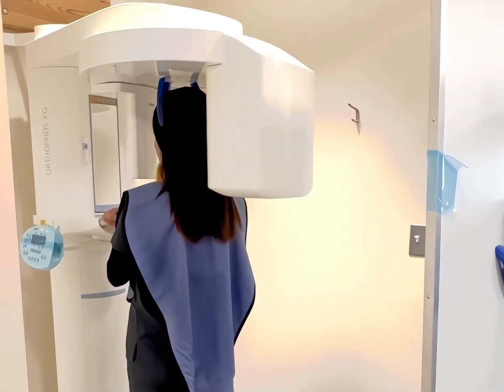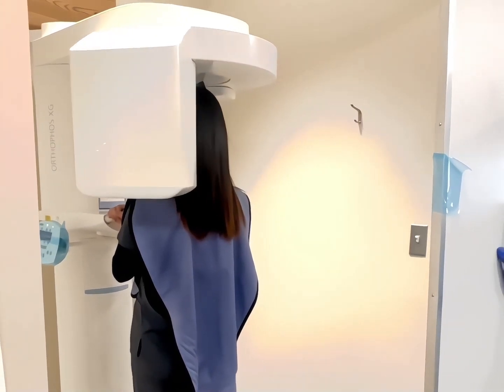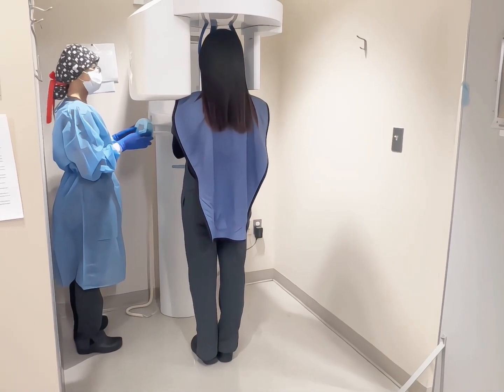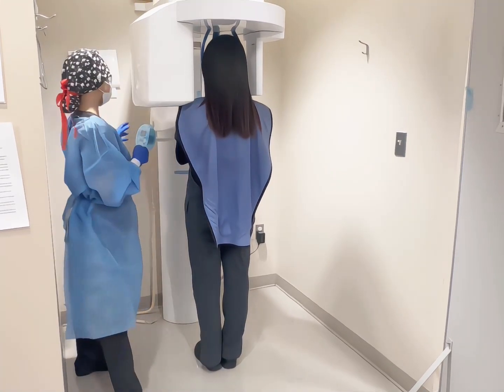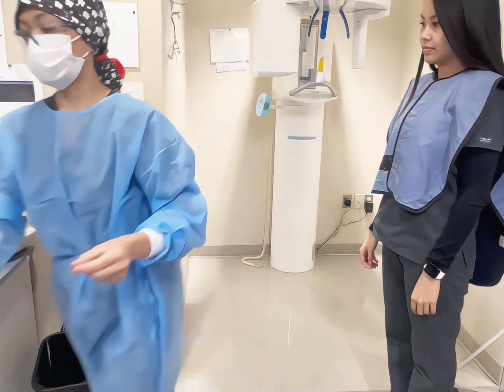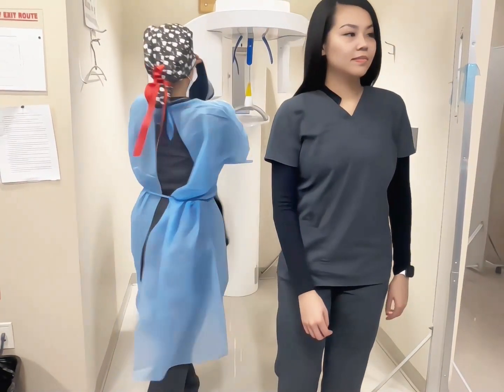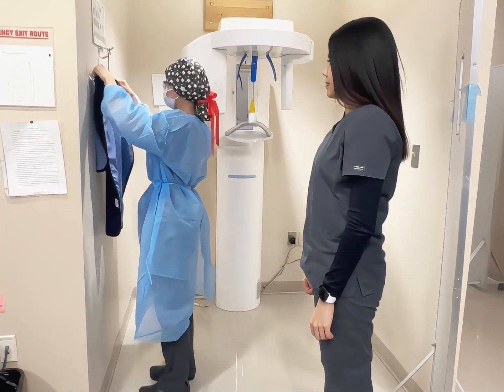Exposure time may vary by unit, but generally it is the mA and kVp that vary with exposure mode and patient size. The X-ray process is finished. Move the lead wall, put the remote control back, adjust the head stabilizers, and have the patient step back. Then remove gloves to take off the lead apron from the patient. Perform hand hygiene. When the patient is clear of the machine, you can press the reset button to return the machine to its start position.